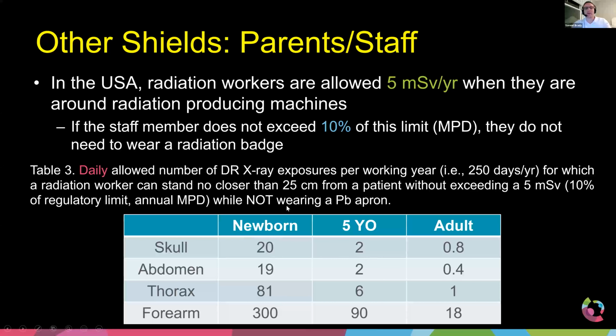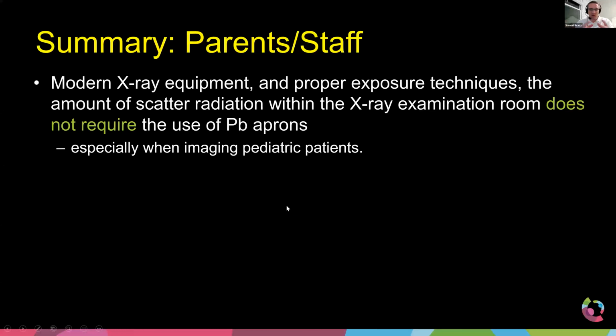So the point here is the amount of scatter coming off of the patient when they are being imaged in an x-ray room, so we're talking DR and CR imaging, is very, very low. And so technically, the parents, when they walk into the room, don't necessarily need lead per certain rules and laws in our country. And technically, the staff could probably get away without it too.